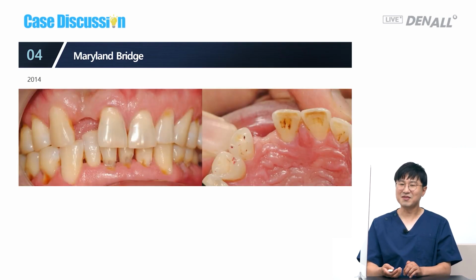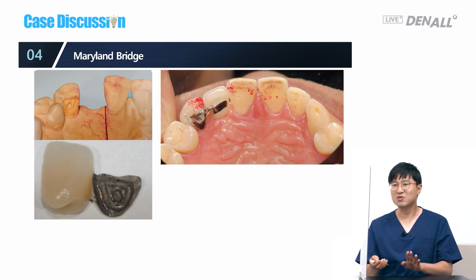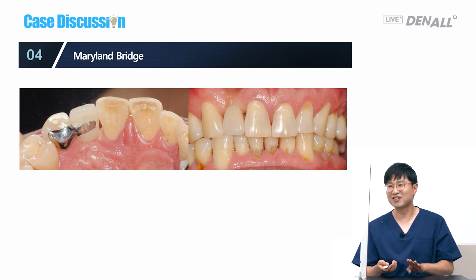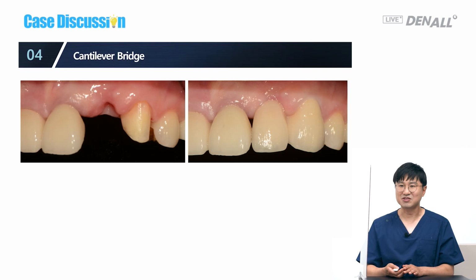The maxilla, I used it only once. There's a problem of using it in the maxilla, and I have no intention of doing it again in the maxilla. It should not be in the occlusion or guide. The area where we can use it is too small and the teeth are too Even though it is not in occlusion or guidance according to the articulation paper, the patient can chew cucumber or bite on an apple. Using the groove, attaching it properly is the key point. 2017, the patient came back for scaling and it is still maintained. I was really impressed by that, but the patient seemed to be thinking, what does it have to be so impressive?